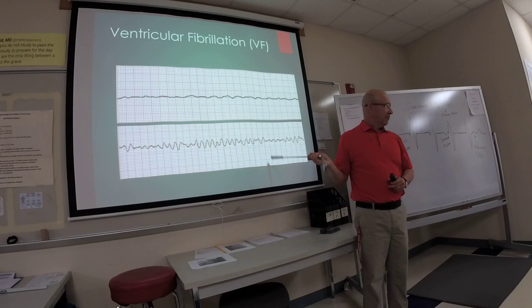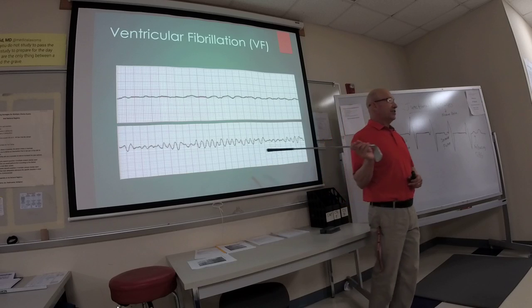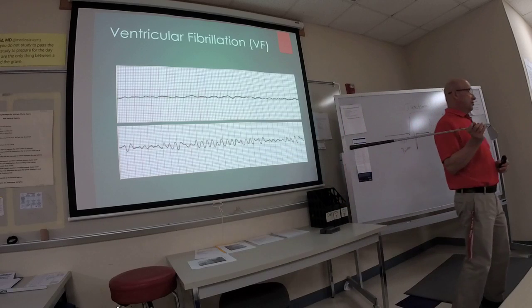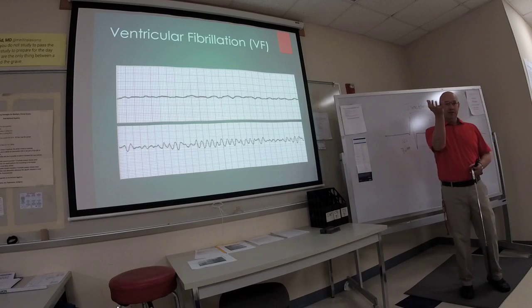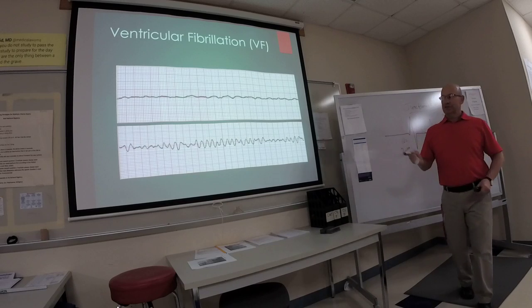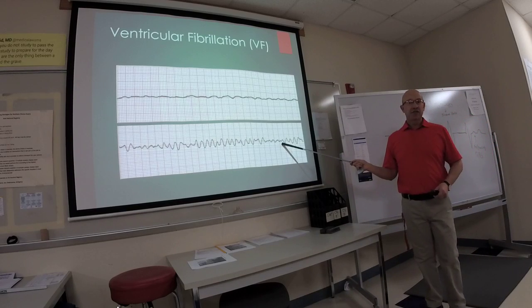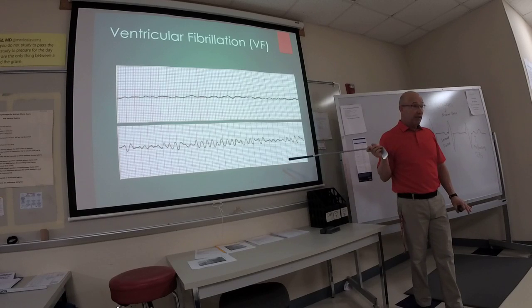If they're breathing, they're not in V-fib. Okay? This is lethal. This means that there's no discernible pulse. V-fib is just a quivering of the heart. It's not going to produce a pulse. Alright? This is shockable.